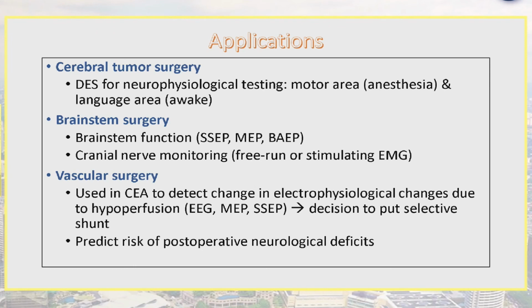So how do we apply this intraoperative monitoring? We do it in cerebral tumor surgery. We do direct evoked stimulation for neurophysiological testing. Sometimes under anesthesia we use motor, and if you do awake craniotomy, sometimes our interest is in language, which we do in the awake patient. Brainstem surgery must use SSEP, MEP, and brainstem auditory evoked potentials because the surgical approach is directly to the area of interest, and the brainstem is a vital structure with a lot of nerves coming from there, so there is a need to monitor.